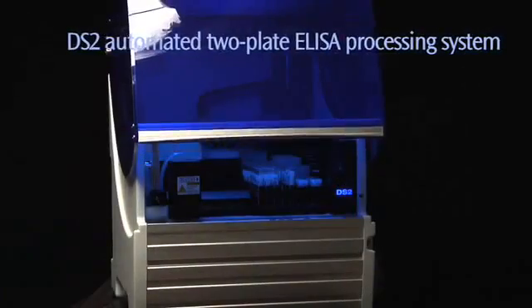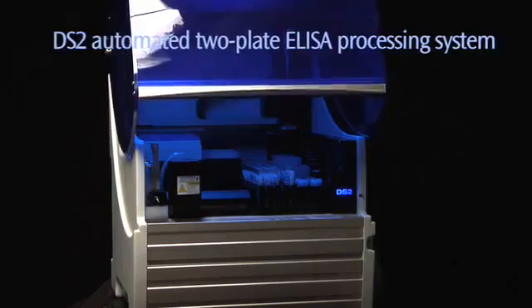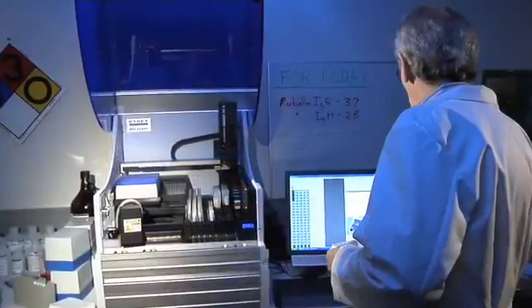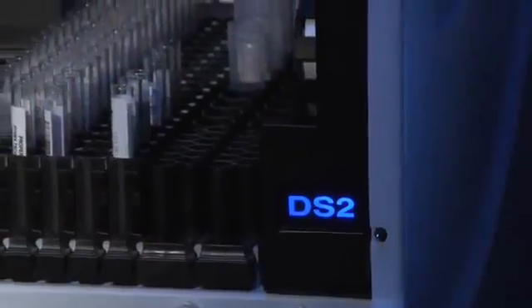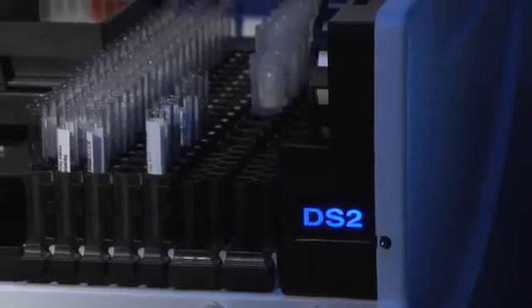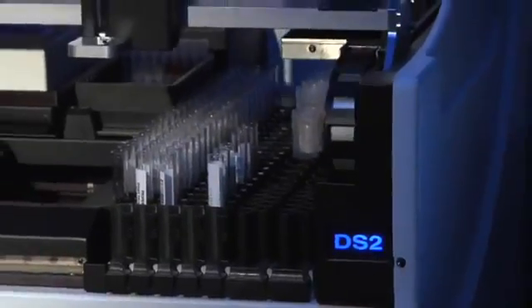Step up to automation with the Dynex DS2. It's ideal for virtually any ELISA application, from clinical diagnostics to food safety and drugs of abuse testing.